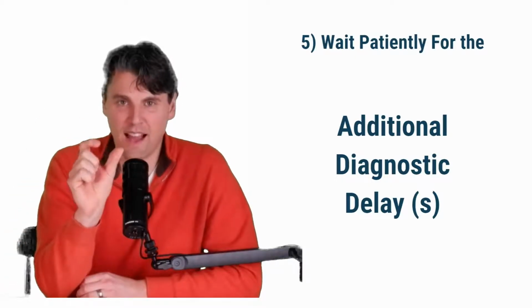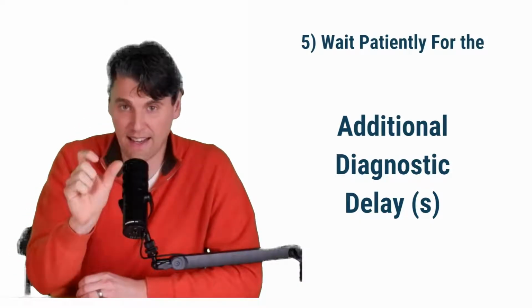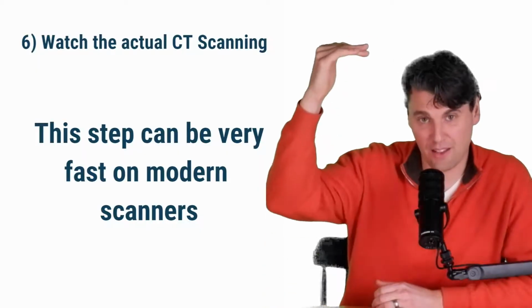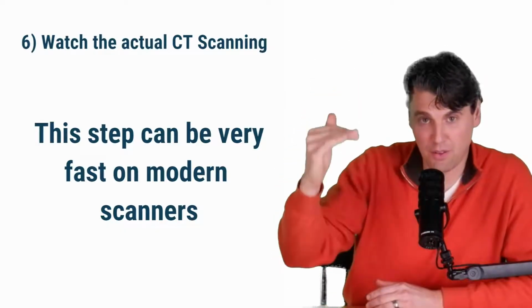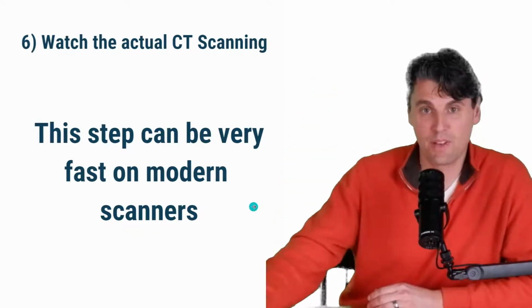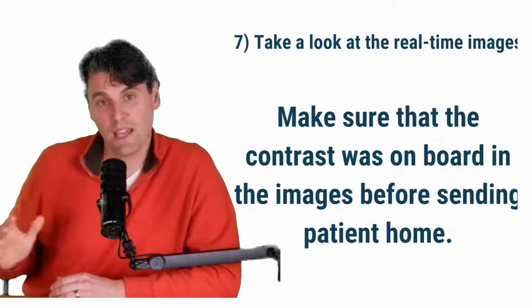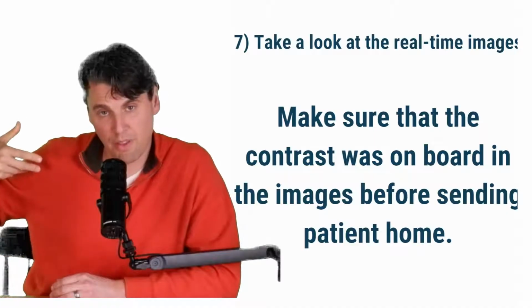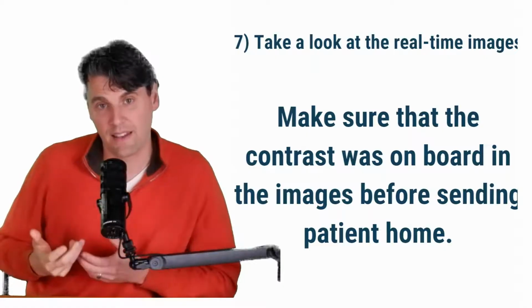So then there's that diagnostic delay that's set in after the threshold's reached. The diagnostic delay counter then starts counting down. Then we get to watch the actual scanning. So this is actually very quick on modern scanners, where the helical scan takes place, the table moves, you get to see images coming up very quickly. We're going to take a look at those real-time images and make sure that the contrast is on board, and make sure that we actually have relatively good contrast opacification before sending the patient home.